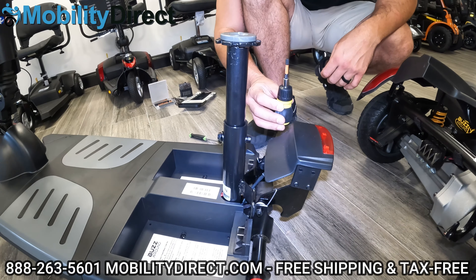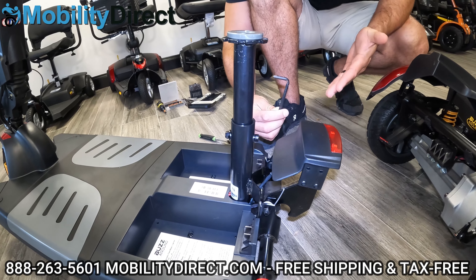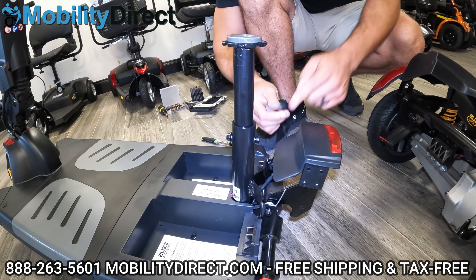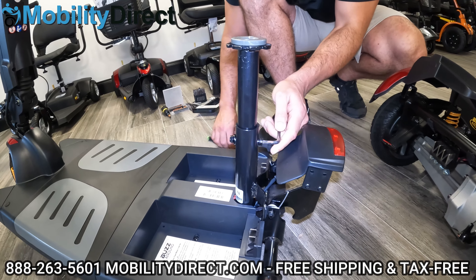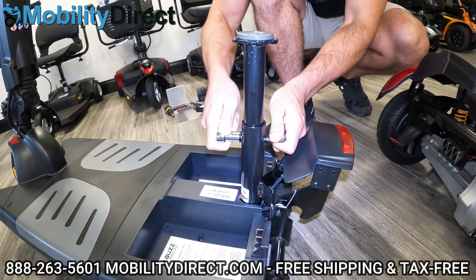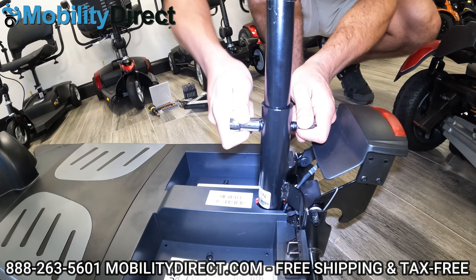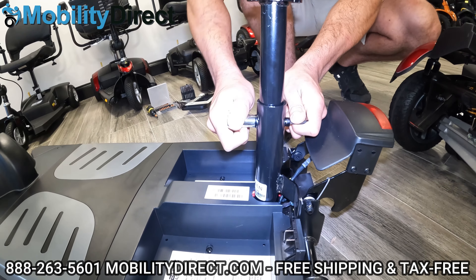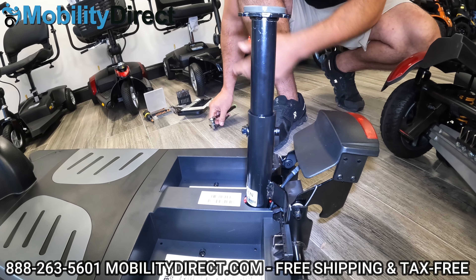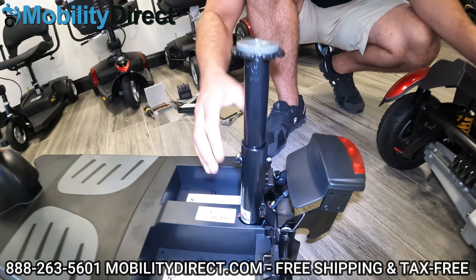The next thing we're going to do is get an Allen key — it should come with one but it doesn't, so hopefully Golden Technologies will start including it in the future. You've got your six millimeter Allen key — put it in there, use the 13 millimeter socket, and just tighten. You don't need to go crazy, but you want to get it hand tight. Especially if you're going to be transporting this on a vehicle lift or going off-road — these scooters have suspension and are off-road capable — you want it nice and tight. Give it the shake test: if it's not moving, you're good.